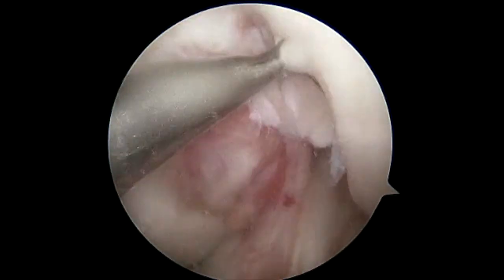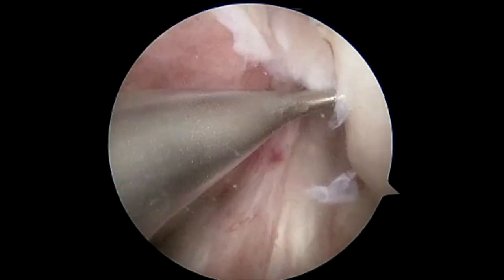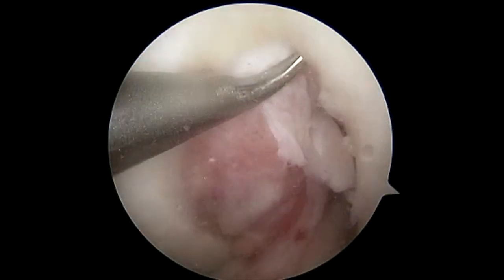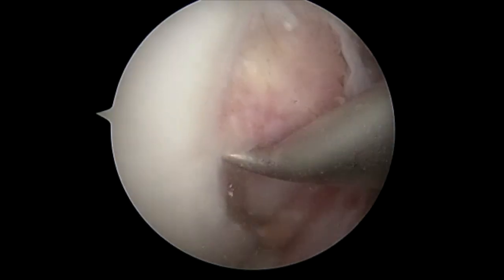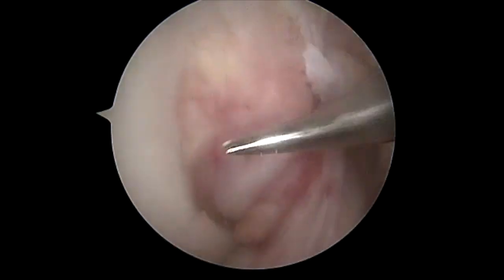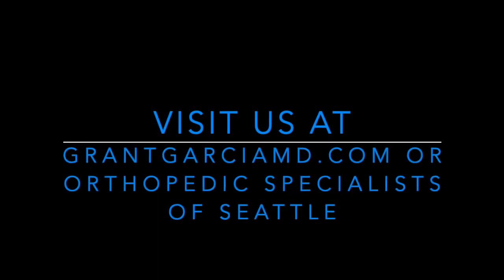To improve healing, based on recent studies showing a 25% improvement without ACL reconstruction, we microfracture the notch. We perform three to four microfracture holes on the medial and lateral side. One key is to switch portals so you don't do any further damage to the notch. After this is complete, we remove the fluid to allow for marrow extravasation to confirm adequate microfracture.